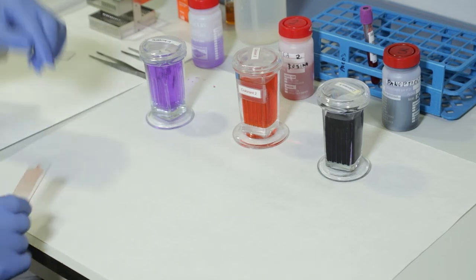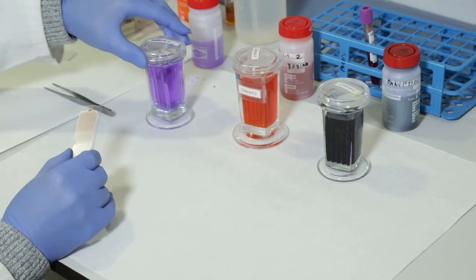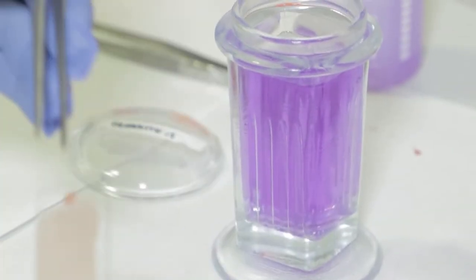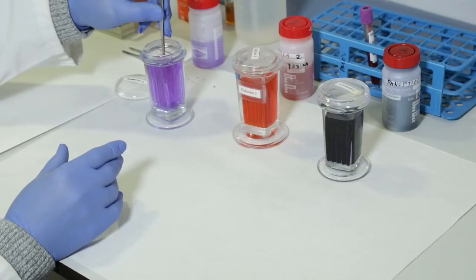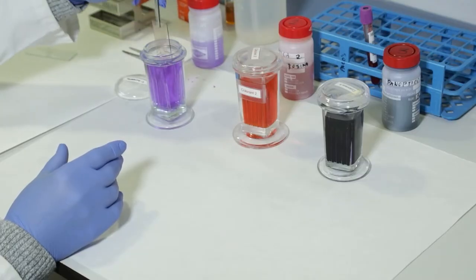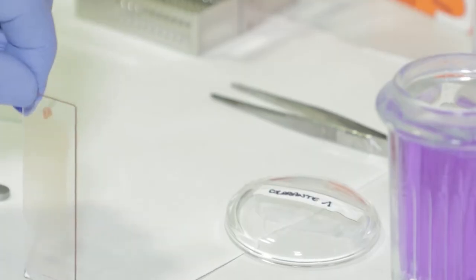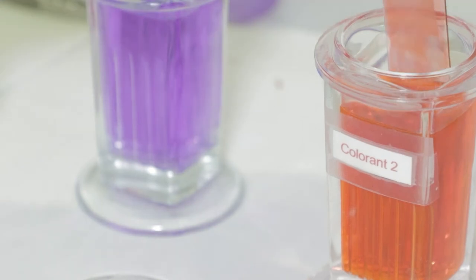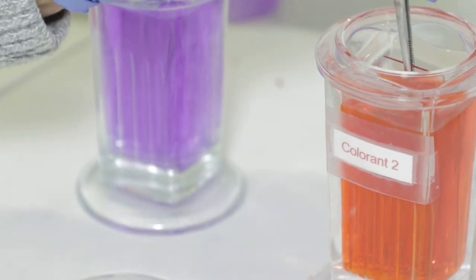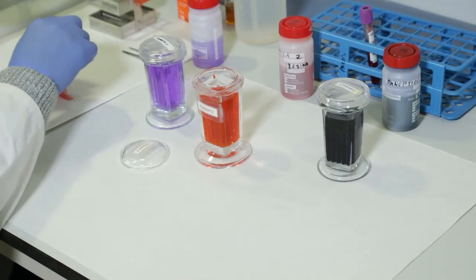The staining pattern is as follows. First, immerse the slide for 5 seconds, 5 immersions of 1 second in fixation solution number 1. Second, repeat the same operation with reagent number 2, which is an acid dye such as eosin.